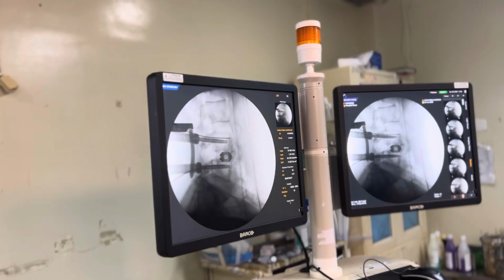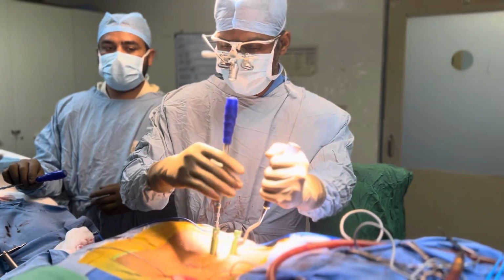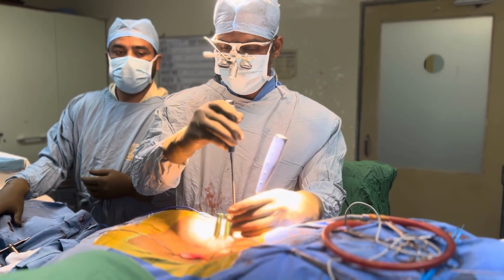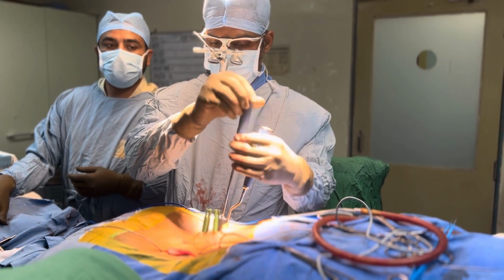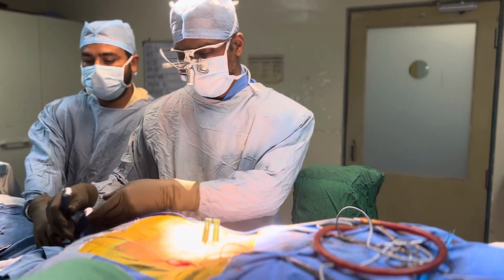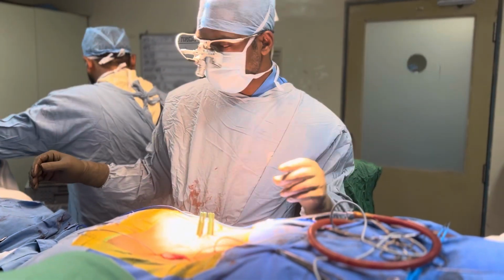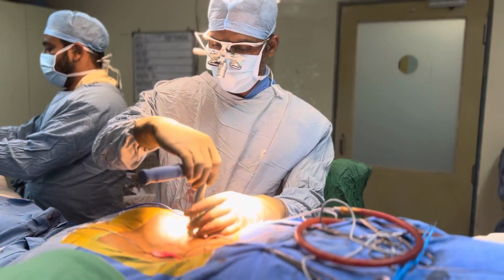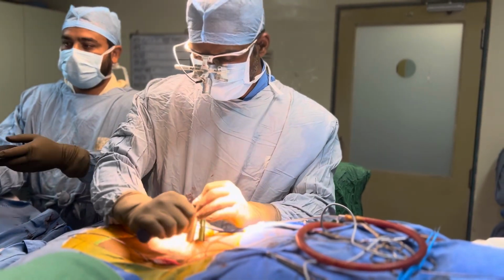All the time the C-arm is in a lateral view only. Now I am putting the nuts. Both nuts are placed, but they are not final tightened. I am removing the handle of the rod and then doing the final tightening of the nuts with the help of a torque limiting screwdriver. Hold it.